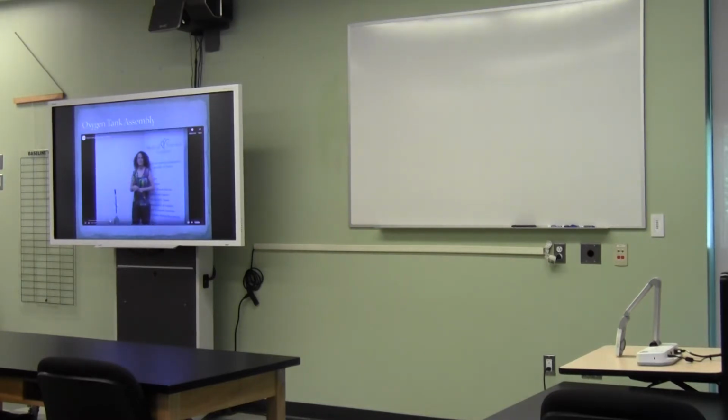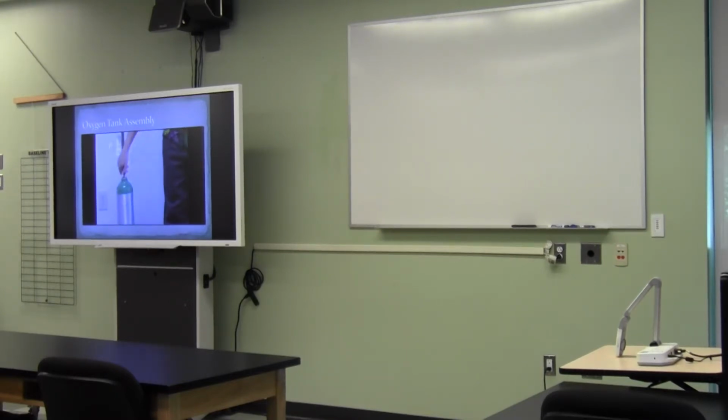I'm Billy Jo with Medical Service Company. I'm a respiratory therapist. I'm here today to show you an oxygen tank. This is your backup tank. You would get this whenever you get set up on oxygen. You can see on the tank here you've got this little white label or kind of a cover. This shows you that the tank is full. You could have a white one, a blue one, a gray one.